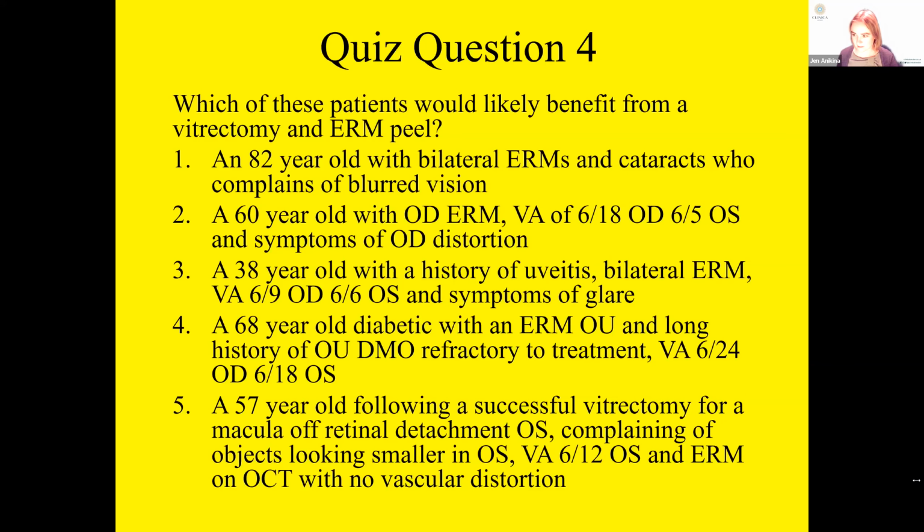And going, gone. So Sheraz, I'm very happy to see the results of this poll. I am thrilled to see the results because you do have a winner for us, which is number 2, my best candidate for an ERM peel. I'll briefly go through these because clinical cases are interesting, to me at least. You're all going to have to follow along on this.